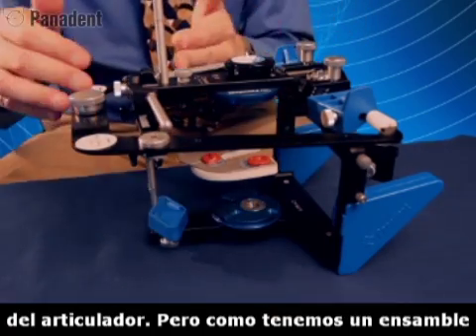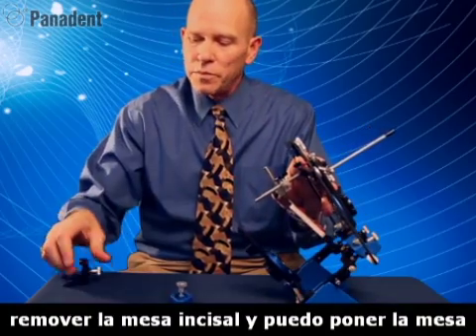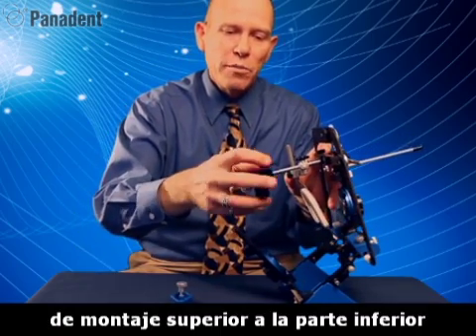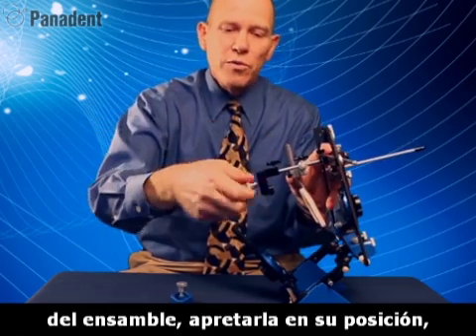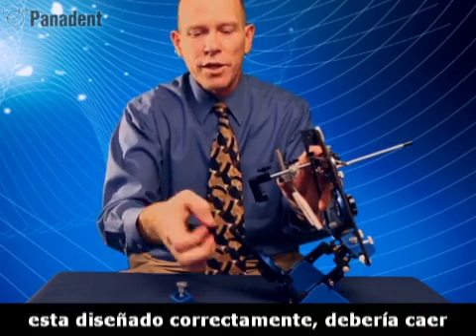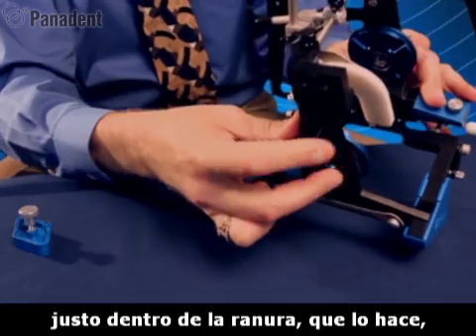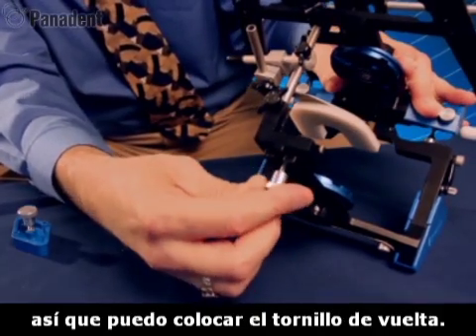Since it has a detachable bite fork assembly, we can actually remove the incisal table and add in the mounting fixture to the bottom of the assembly. Tighten it in place, remove this bottom screw, and if everything has been engineered correctly, this should fall right down into that slot and forward into that slot — which it does — indexing this thing correctly. So I can add the screw back.